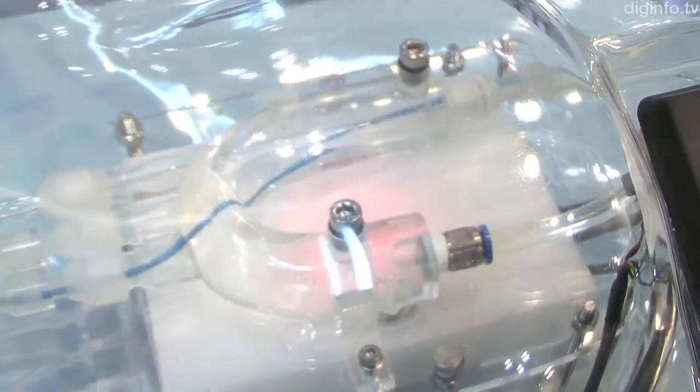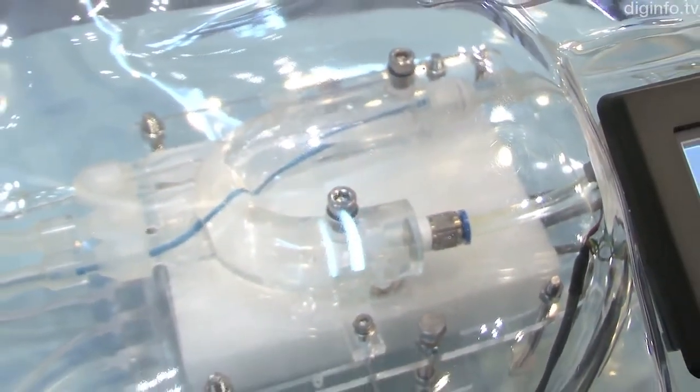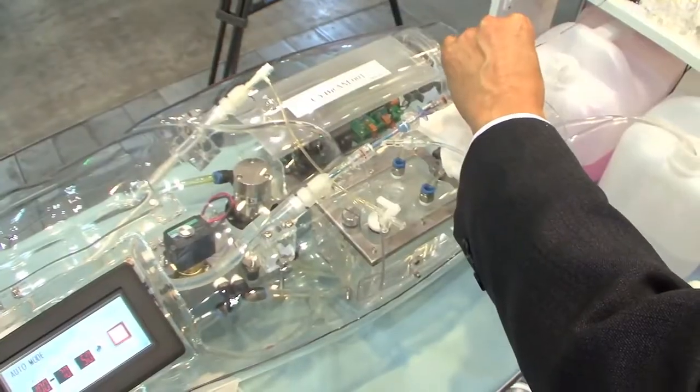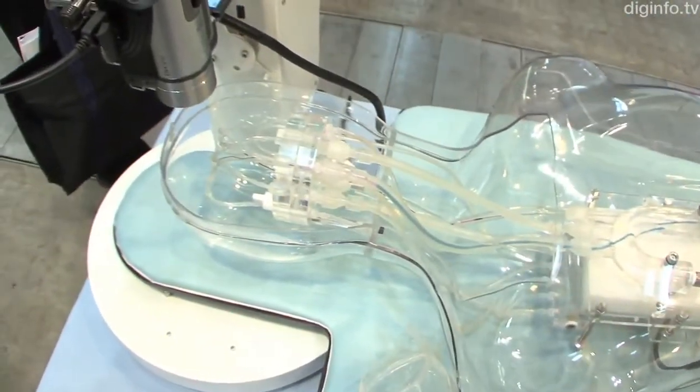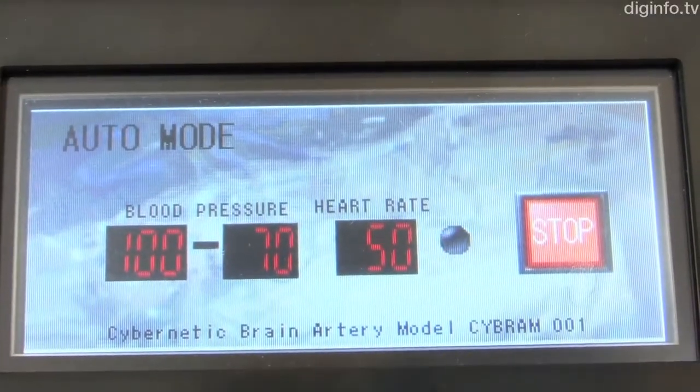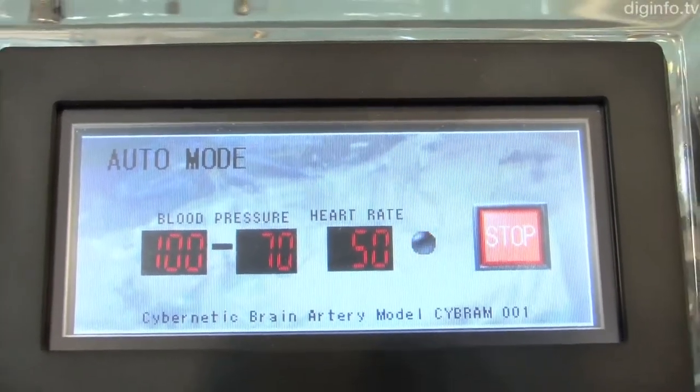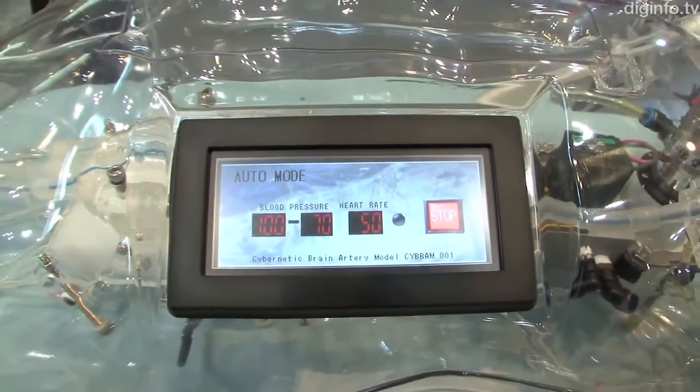The small pump unit embedded in the body is automatically controlled based on information transmitted from the blood pressure sensor, and the blood pressure and heart rate can be set through the touch panel. The maximum and minimum blood pressures and heart rate are constantly displayed in real time during operations.